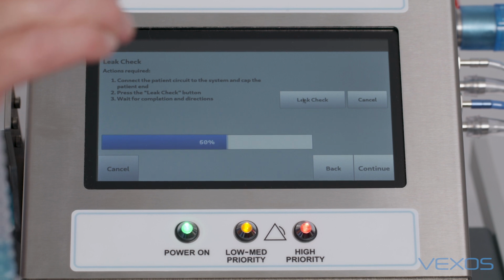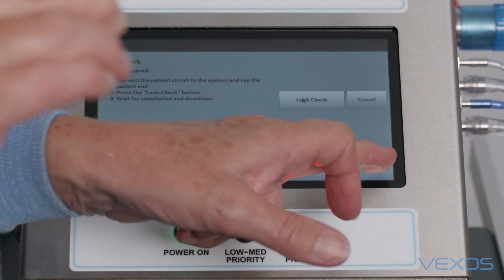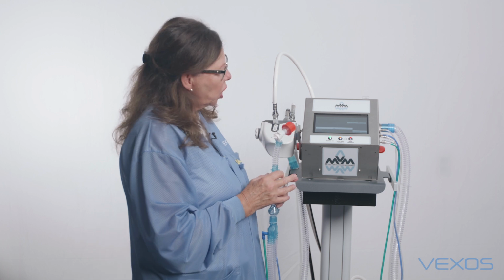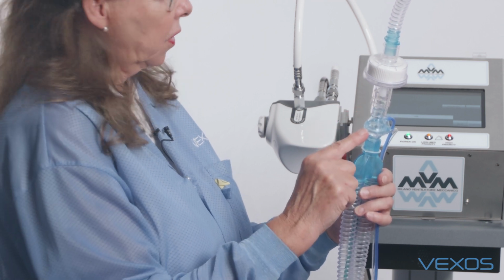Once 100% of the check has been completed, success, that test has been finished. Continue. The next check is the flow sensor direction check. It's making sure that the operator set this correctly in the circuit.